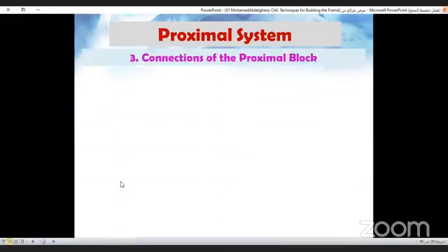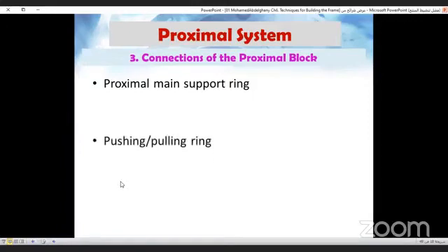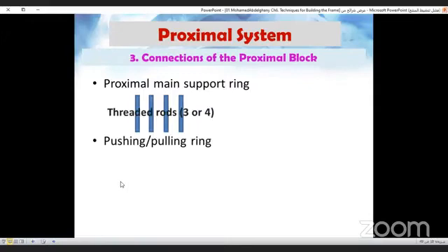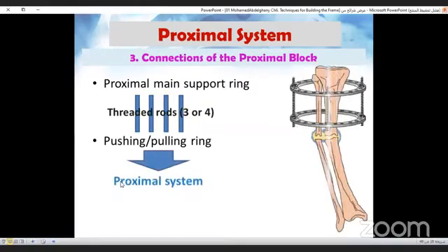Now we come to the connections of the proximal block. If we connect the proximal main support ring and the pushing pulling ring with three or four threaded rods, we now get the proximal system.